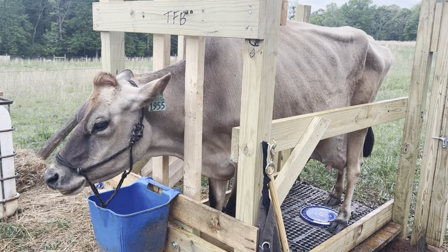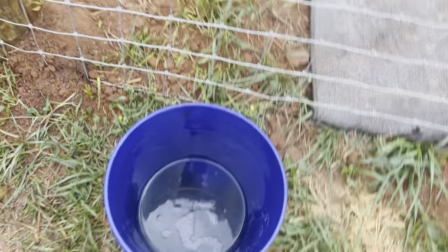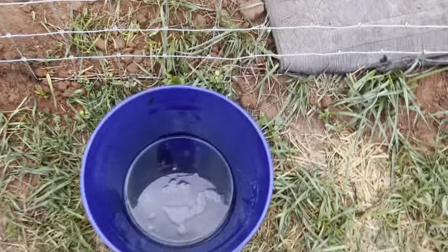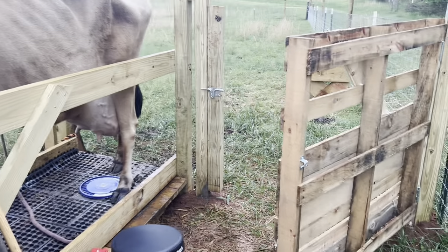Today I want to show you how we test with the ketone strips. She's not in a good mood, so I have caught some of Butter's urine here in this bucket, because as soon as she starts to pee I can just throw that bucket under her back end and catch some. You literally only need a tiny bit — you could test off the ground if she were to pee. You can see we have those little cells in between our mat.